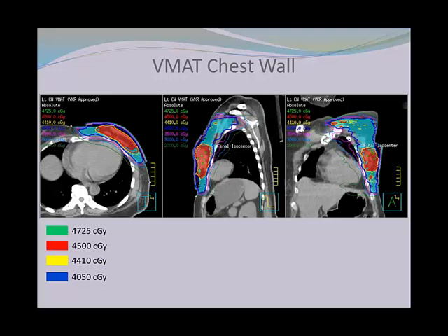I just want to discuss with you about electron chest walls. You use electron chest wall for patients that are very thin. The patient's anatomy is so thin that you couldn't treat it with the regular photon tangents and supraclav.